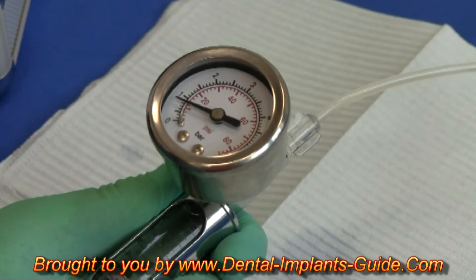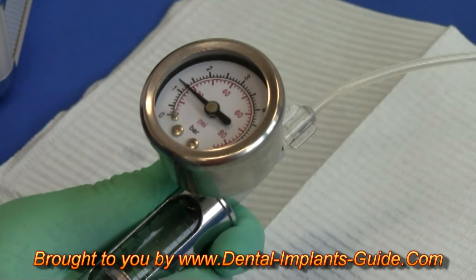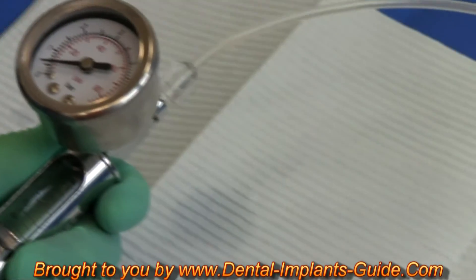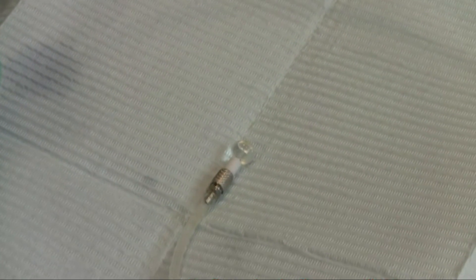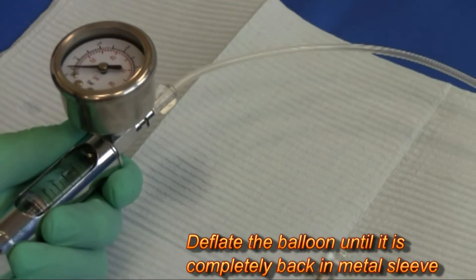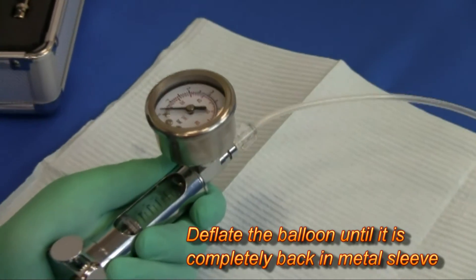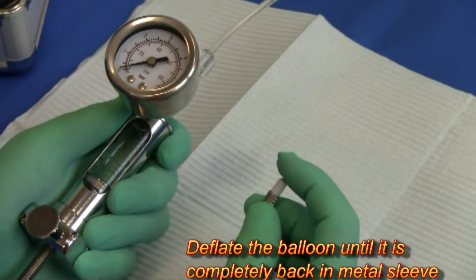Once the needle drops, it will indicate that the balloon has inflated. Next, deflate the balloon by slowly turning the blue handle counter-clockwise. Return to the original starting position and ensure that the balloon is fully back within the harboring device.